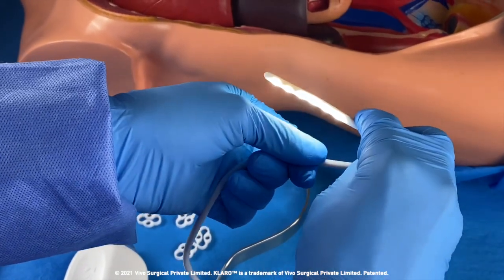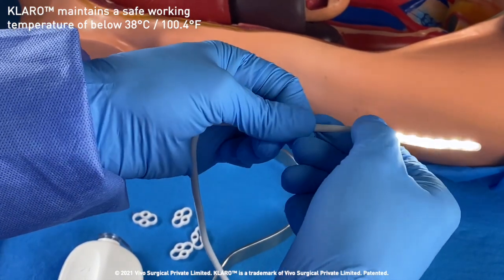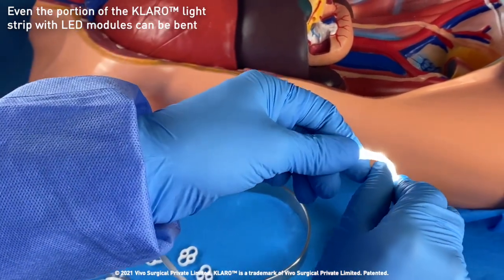The device maintains a safe working temperature of below 38 degrees Celsius. Claro's light strip can even be bent along the portion where the LED modules are located.